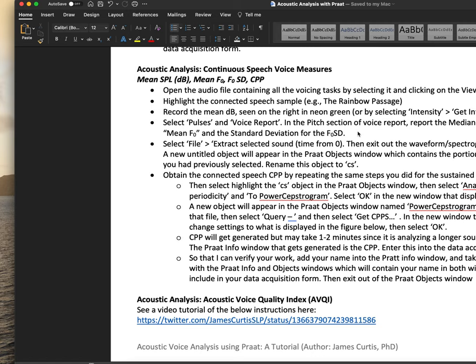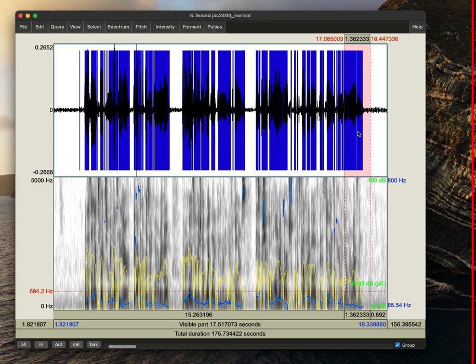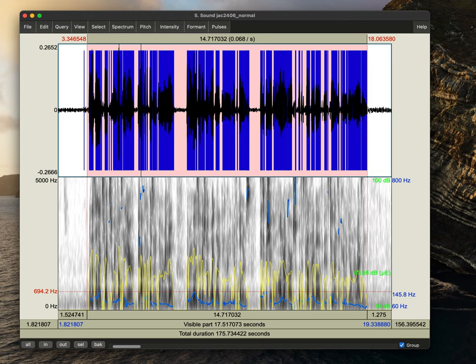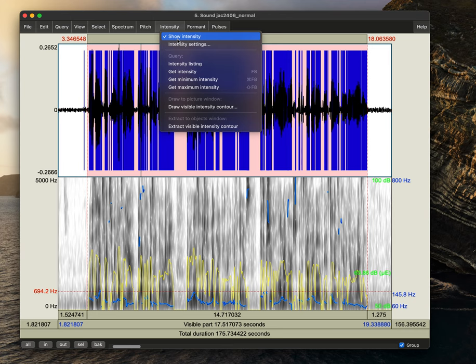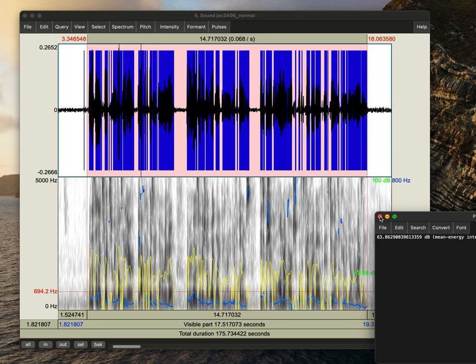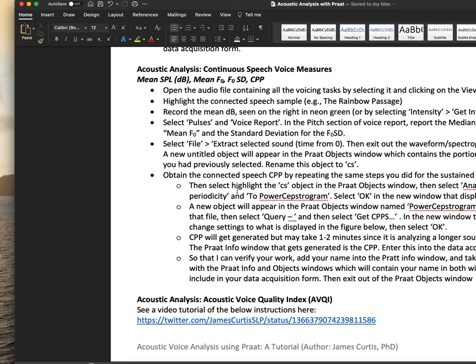So the first thing that we're going to want to do for our connected speech measure is identify mean SPL. And so here we would highlight the entire sample and we can see that the mean SPL is 63.8. Again, just to verify, we see that it's 63.8 decibels. We would add our 5 dB on top of that and have about 68 decibel for the mean dB.